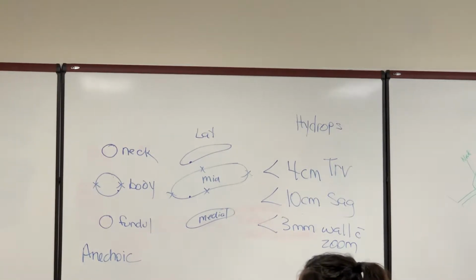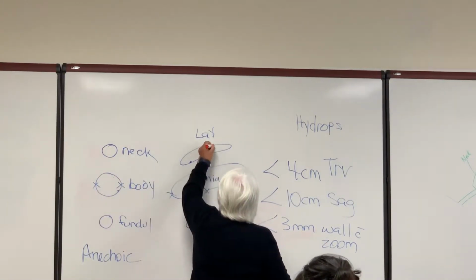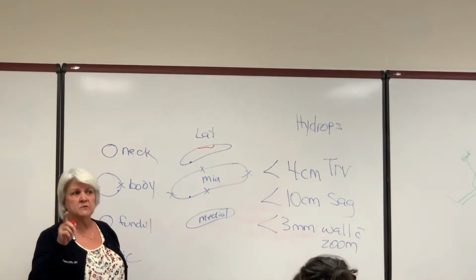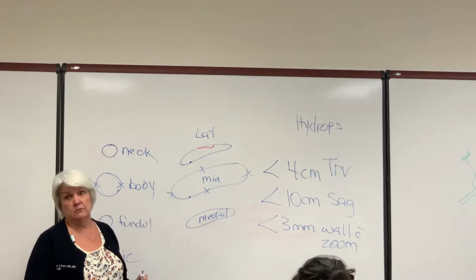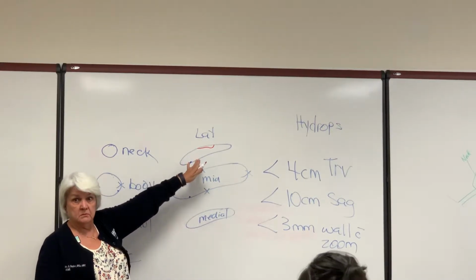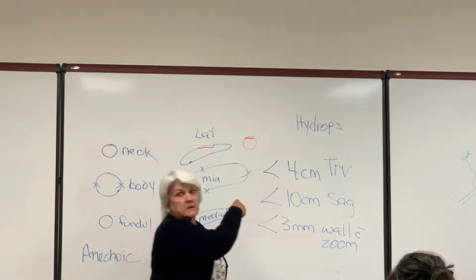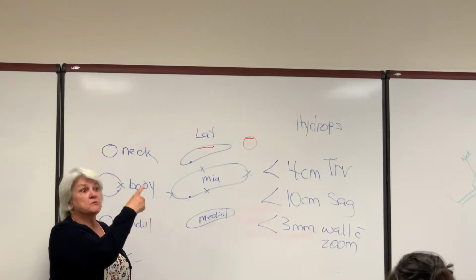Like if the doctor says, well, you know, Ms. Shepherd, what is this right here? You know what, doctor, I wasn't focused in on that. I was looking at the inferior wall. Let me go see if I can duplicate this again, and I'll let you know. So what am I gonna do? I'm gonna reproduce this image. I'm gonna dual screen it, and I'm gonna show him, yes, it's real. It's in transverse 2. I'm sorry I overlooked that. My eyes were focused on something else.